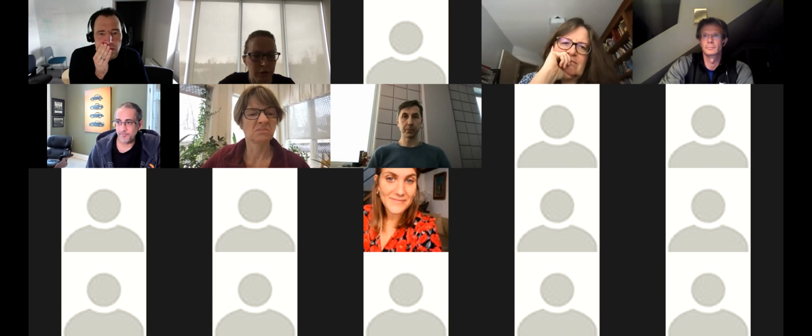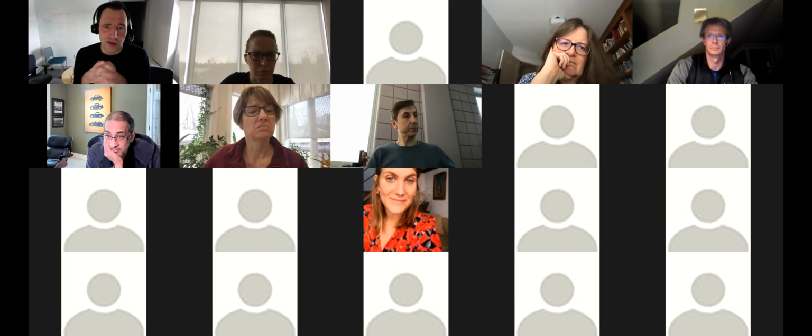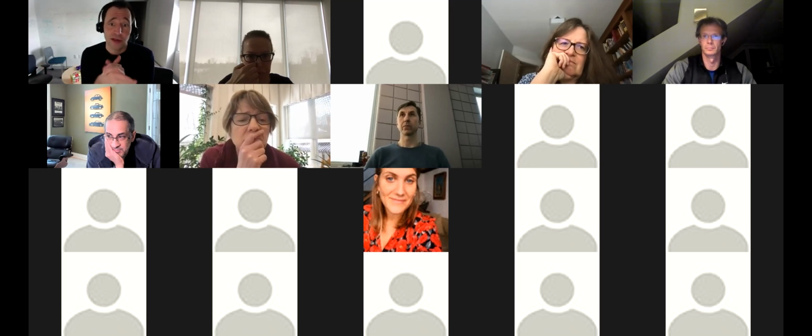So Jorn, you had a question? Yeah, I had a question to Benedict, I guess, mostly. For the multi-echo stuff, we played around with different echo times for deep cerebellar nuclei and globus pallidus, basically nuclei that contain a lot of iron, where the T2 star drop-off is very fast, to get some good functional signal. And obviously, the optimal echo time for a single echo sequence would be shorter, right? You would want to go a little bit earlier.